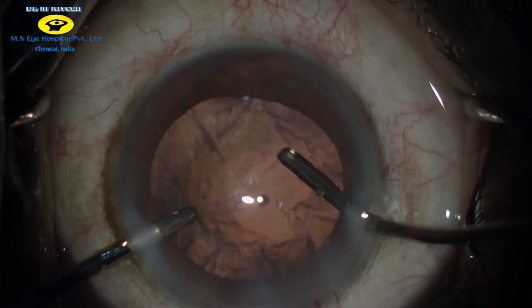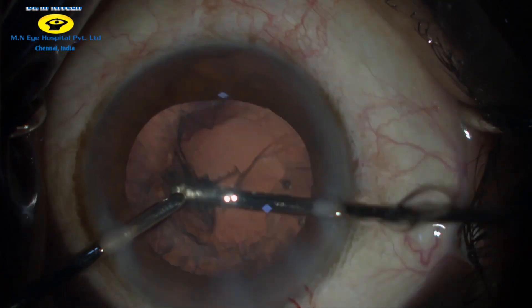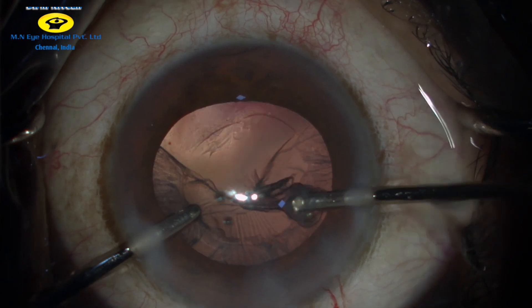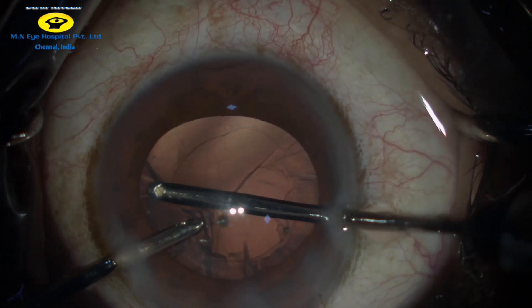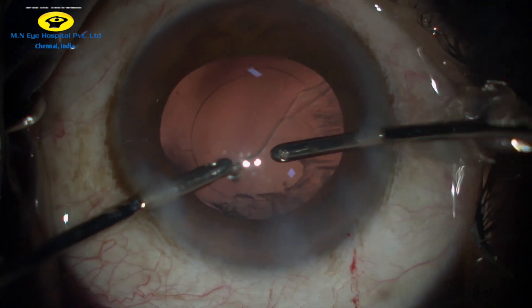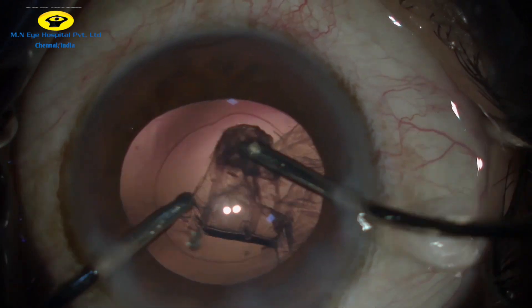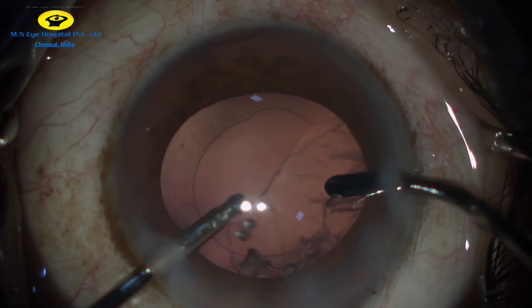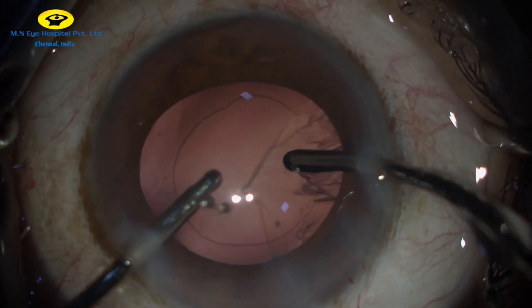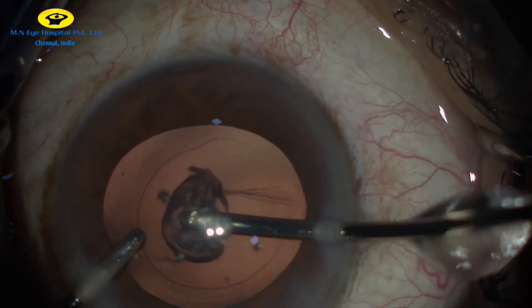Bimanual irrigation and aspiration is then done. The cortical fibers are stripped towards the center and aspirated in a very controlled fashion. The irrigation is kept on one side without much movement. Aspiration of cortical fragments at the sub-incisional site can be done by gentle rotation of the wrist, due to the angulation of the irrigation and aspiration cannulas. This is also known as the rock and roll technique.